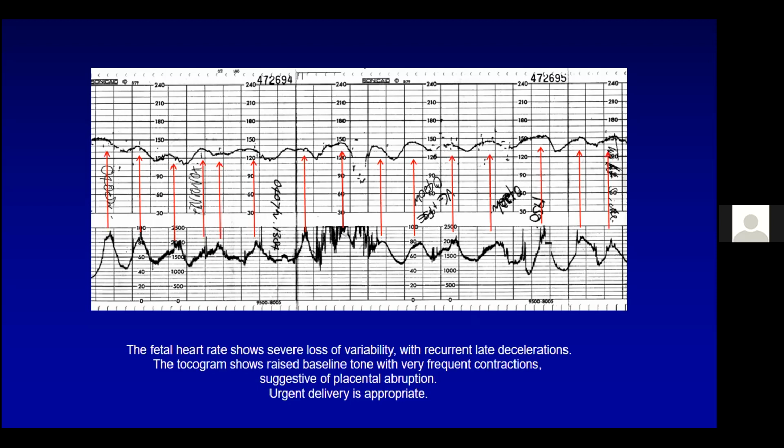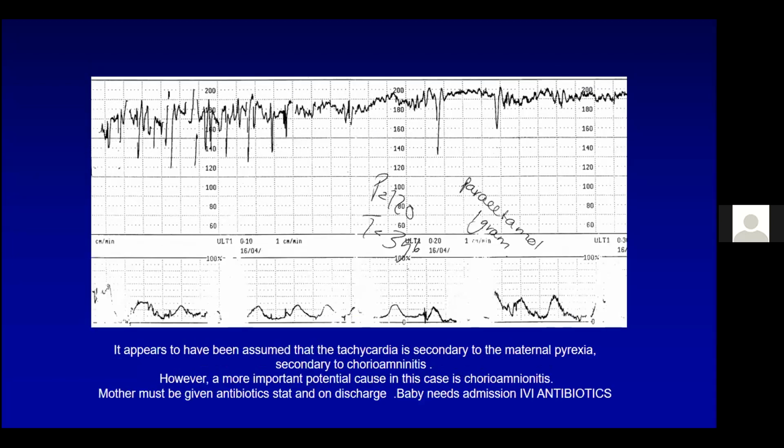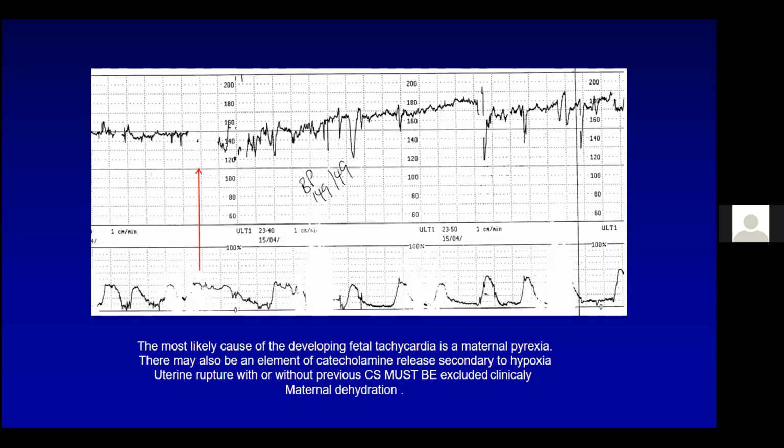If you have this type of case, you have to decide if it's really worthwhile even going in to do the Caesar in the district hospital, because she could have a coagulopathy. So depending on your institution's or the provincial policy, it may not be a good idea to do this Caesar, because you may find that the baby will come out as an FSB, and the mother will have a coagulopathy.